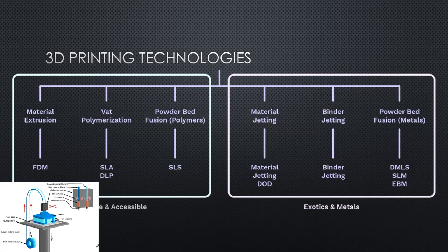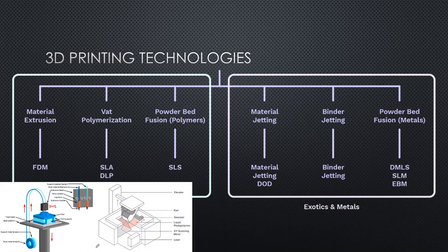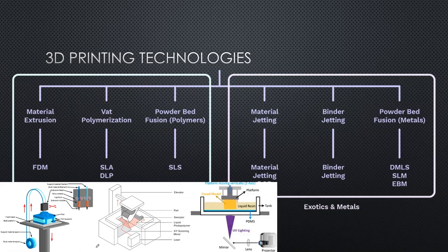And this is what you'll find in your hobbyist type printers, where you have a plastic filament and it gets heated up and deposited into the desired shapes. So very limited use in dental 3D printing specifically, but it's currently the only way that you can print Valplast actually. So that's FDM for you. Traditional SLA uses a single laser and some mirrors mounted on motors that rotate and draw everything out. It's a very slow process because the printer is essentially drawing everything out on each layer. DLP is a projector that does the exposing rather than the laser, in contrast to SLA.